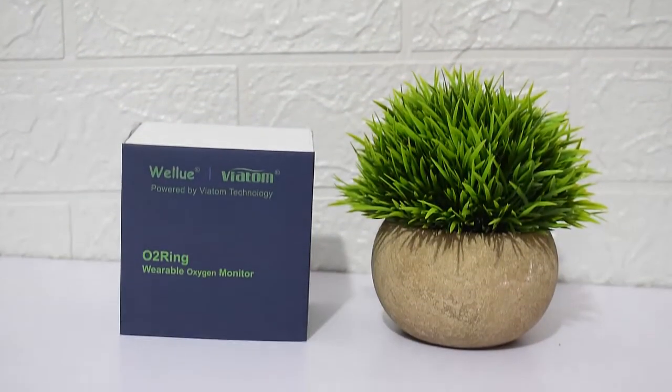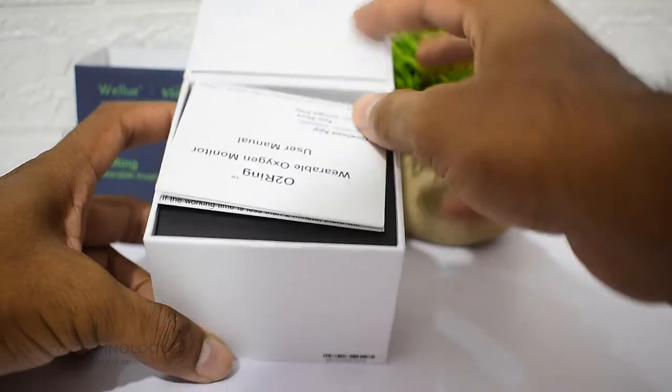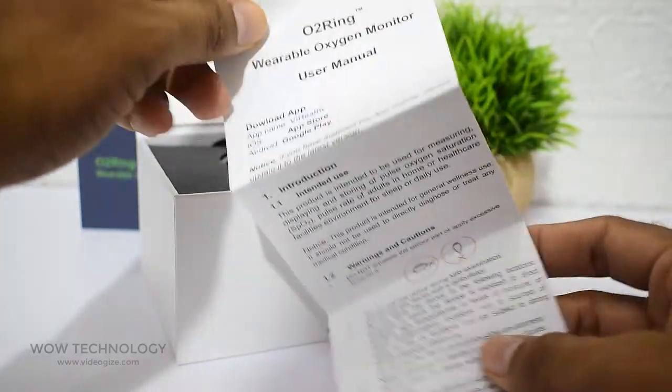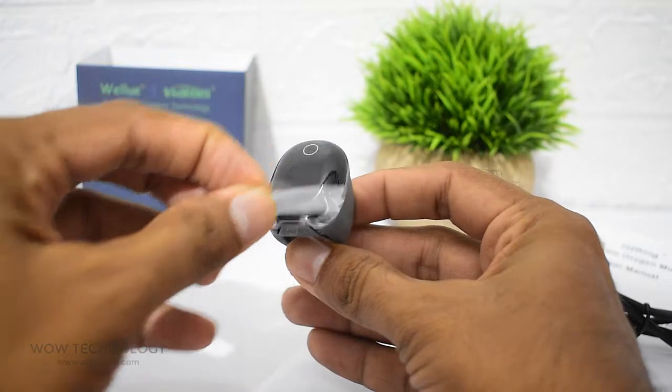Today we will talk about this amazing Wellu O2 ring — let's unbox it. The packaging is simple. You will find a user guide, USB cable for charging, and an O2 ring.